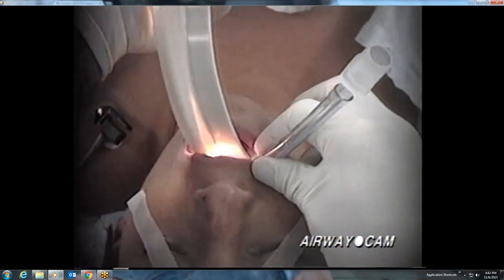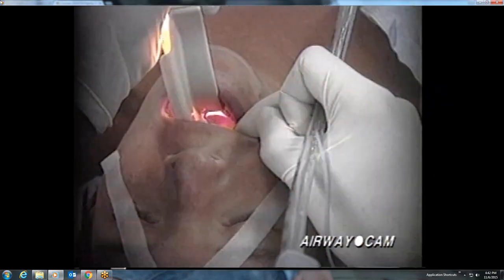In this still shot, note how the laryngoscopist holds the endotracheal tube between the thumb and middle finger of his right hand. This allows the laryngoscopist to remain visually focused on the target without looking away in order to grab the endotracheal tube. Notice that the tube does not have a stylet. As already mentioned, styleted tubes are easier to manipulate and recommended for all emergency intubations.